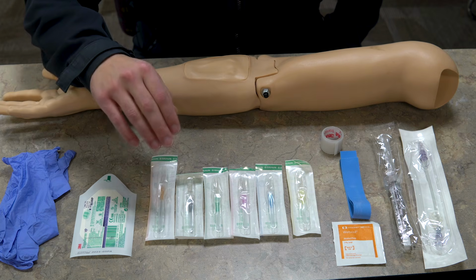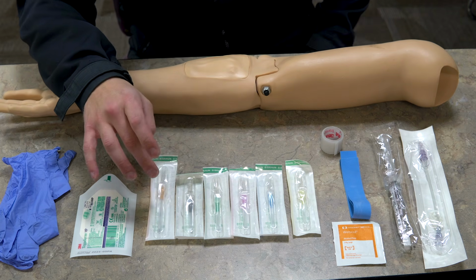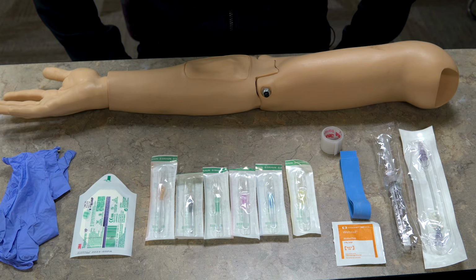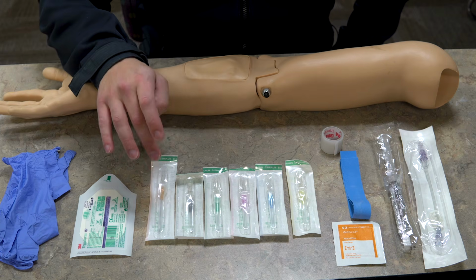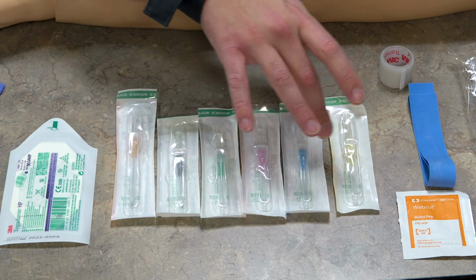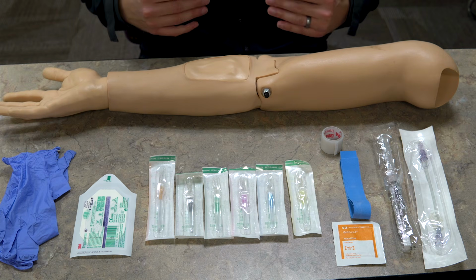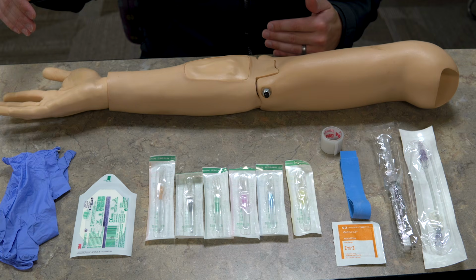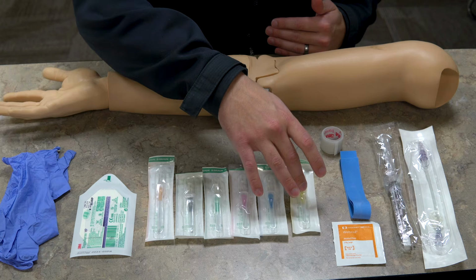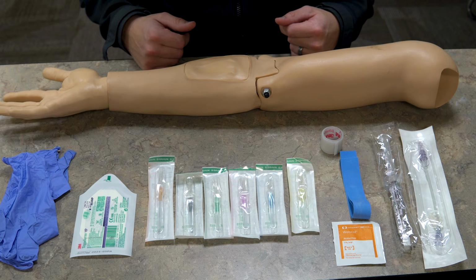So the catheter is the actual needle that's going to be placed into the patient. It has a couple different parts, and we'll talk about that in a second. But in front of you, I have all the main sizes of IV catheters. On my right here, I've got a 14 gauge, 16 gauge, 18, 20, 22, and 24 gauge catheters. Now, catheters are sized kind of like shotguns are. So the smaller the gauge, the larger the needle is. So your 14 is the largest and your 24 is the smallest. There are different sizes, but these are the main ones you're going to see.